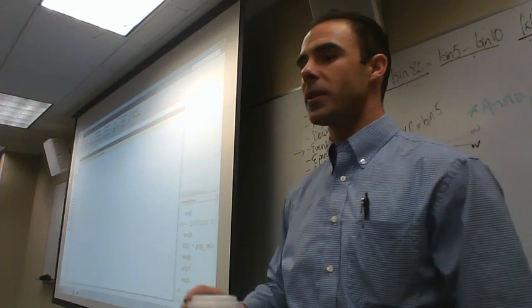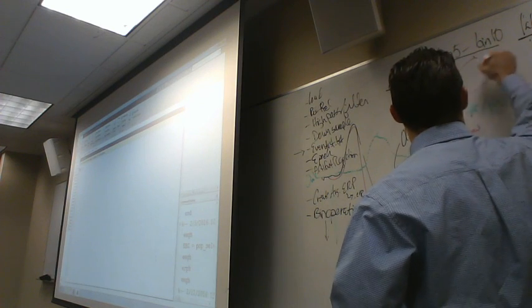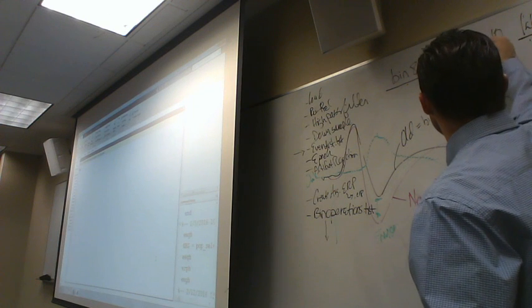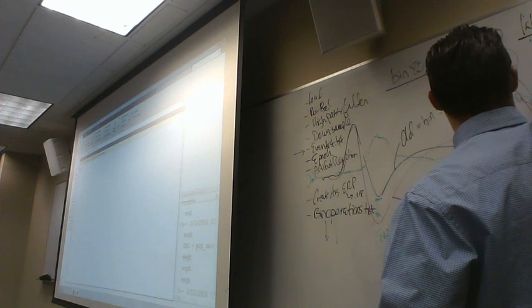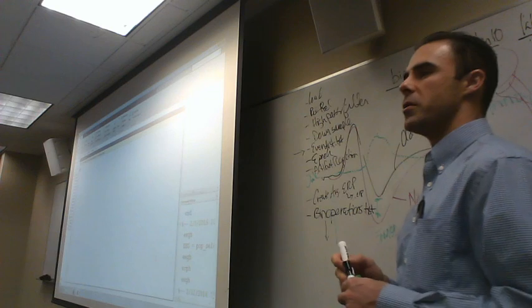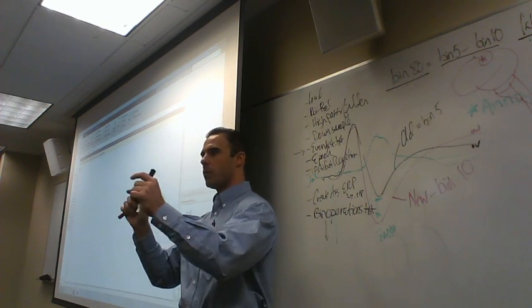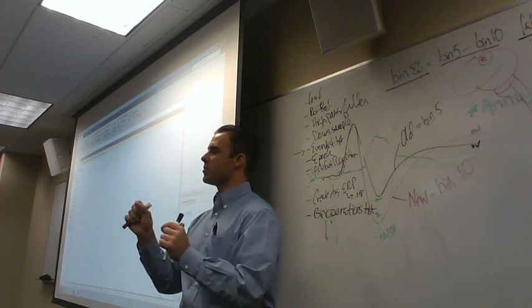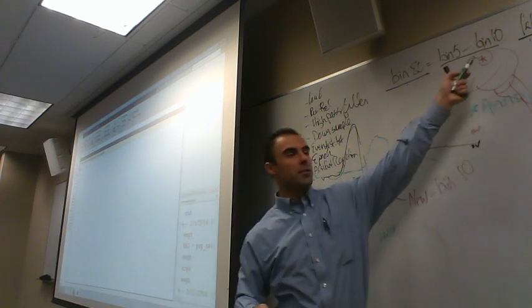Exactly. That's it. It is mathematically impossible to know exactly where in our brain a given pattern of activity at the scalp can be localized to some type of subcortical location, because there's an infinite number of possible solutions of neural organizations of different patterns of neurons that could theoretically and mathematically give rise to anything you see at the scalp.